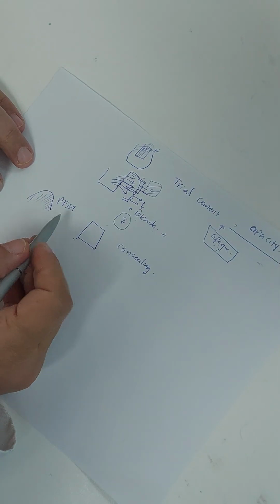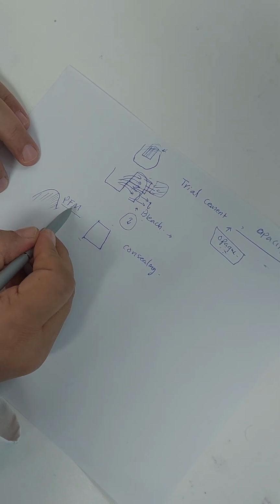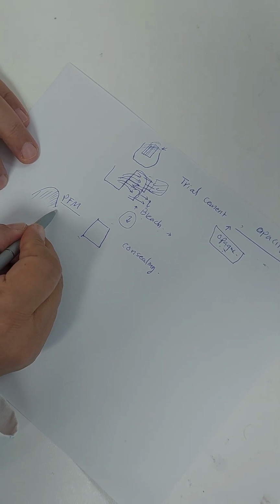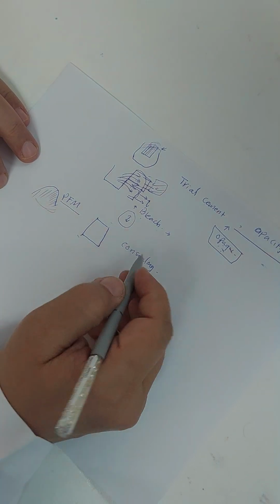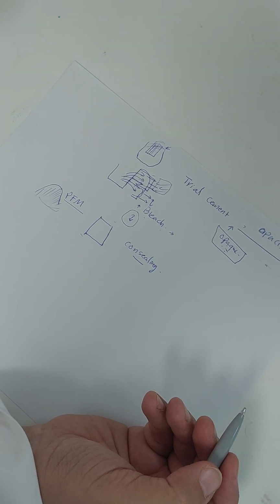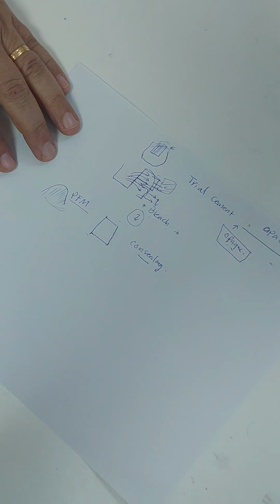So for porcelain fused to metal crown and bridge work, it's enough to cover it with opaque, but make sure you have a porcelain margin in the aesthetic zone. That solves the tooth. The other thing is if we're going to use aesthetic material or ceramics like lithium disilicate or Emax, which is a porcelain type. This is where the issue comes.